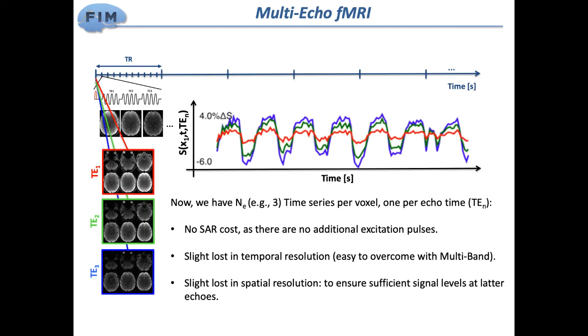And as we will explain, you can either use it, or if you acquire your data in such a way that one of these echoes would be similar to your regular single echo, you could do a first analysis in which you just look at your echo 2, and maybe if your effect size is strong enough, that's good enough. And if not, you can do several things that go from simpler to more complicated in order to hopefully improve the final signal-to-noise ratio of your data.